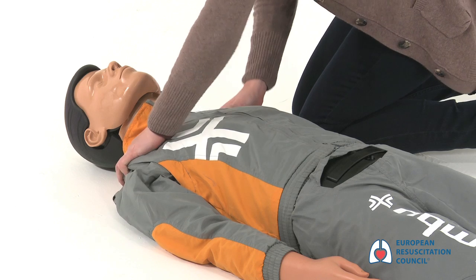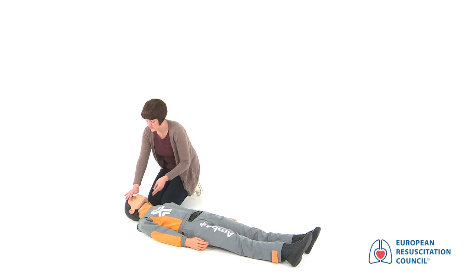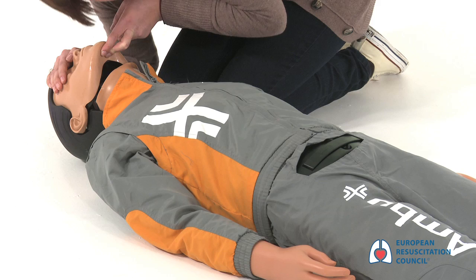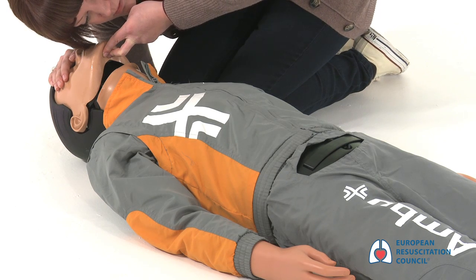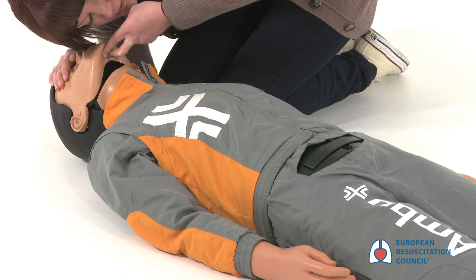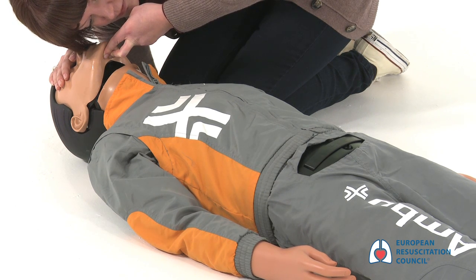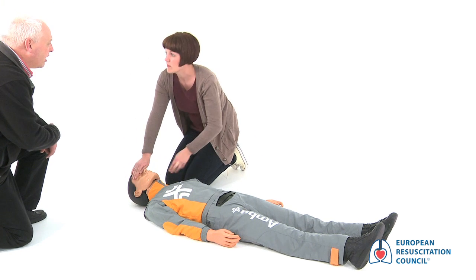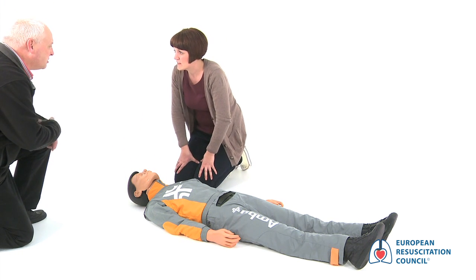Are you alright? Help! Can somebody help me please? How can I help you? Call for an ambulance and bring me an AED.